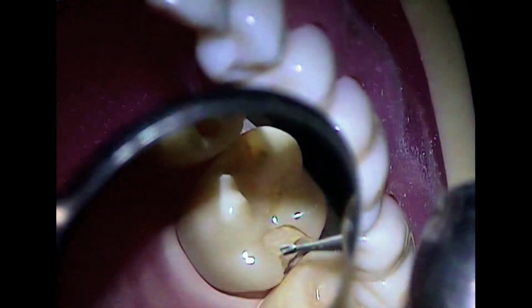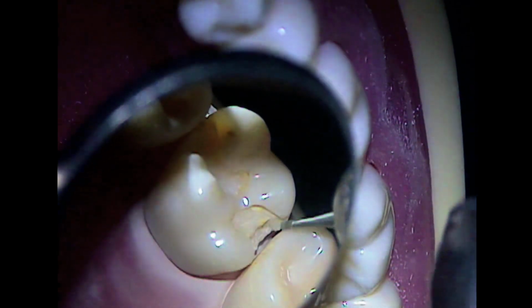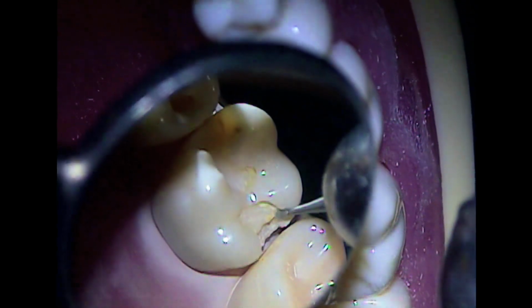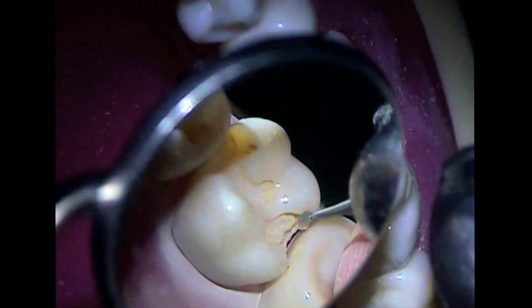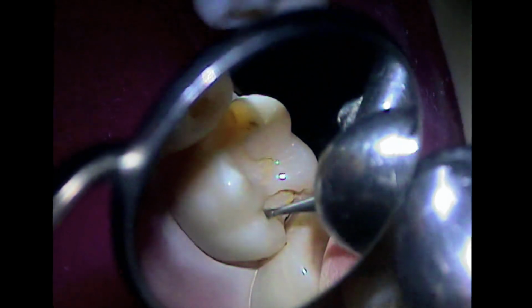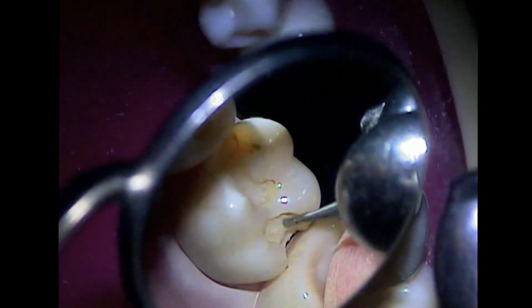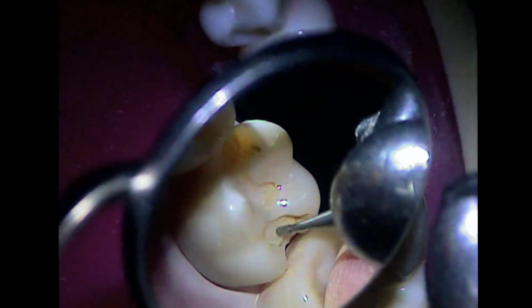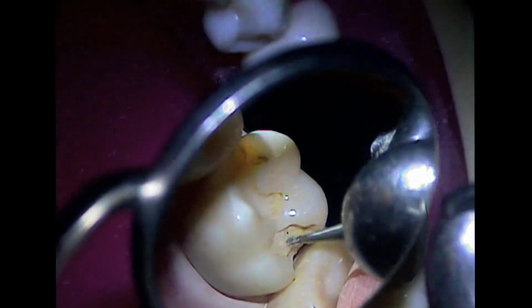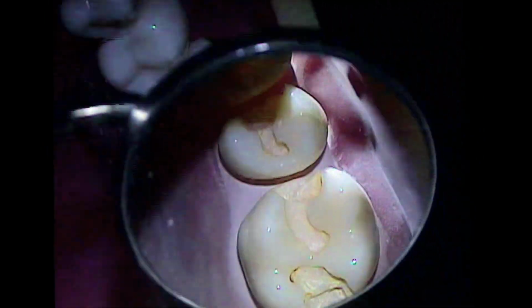All right, and then when you're cutting along the oblique ridge, look this way. So find your margin, find your angle, get the length, and once you've got the way you want there, then look this way and come all the way along the oblique ridge like this. And following the distal lingual groove. You see, the way I'm looking, I can see exactly where I am relative to the oblique ridge. I'm not going to cut up here because it's easy to see if I'm cutting too close to the oblique ridge. The way I'm looking, it's really easy to see where I am relative to the oblique ridge, and that's the key to the whole thing right there.